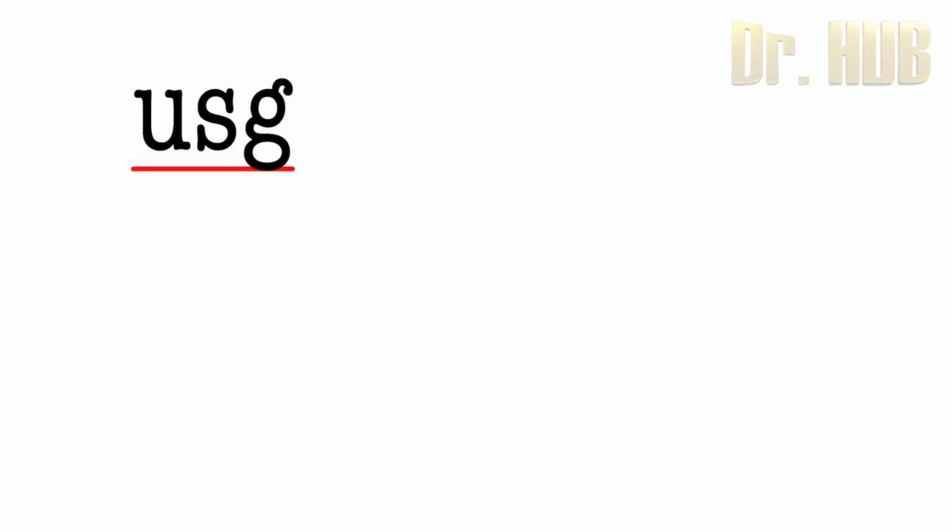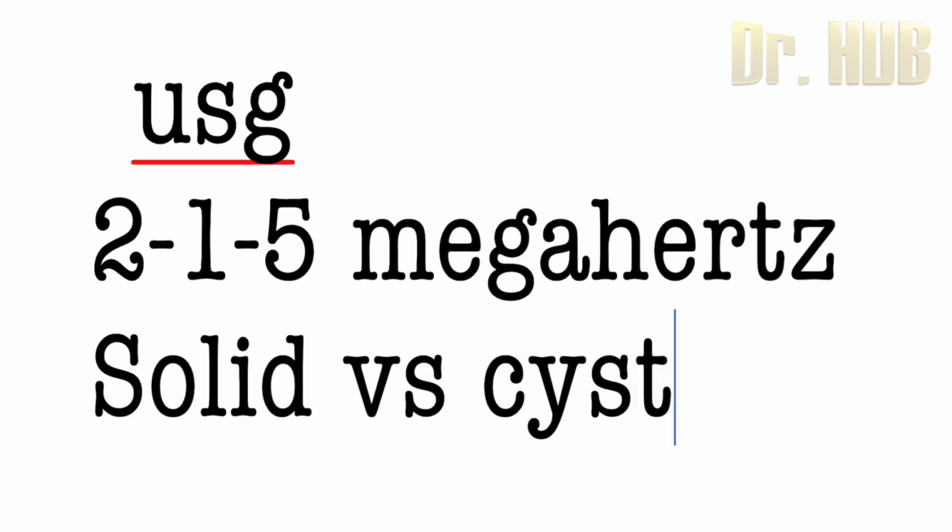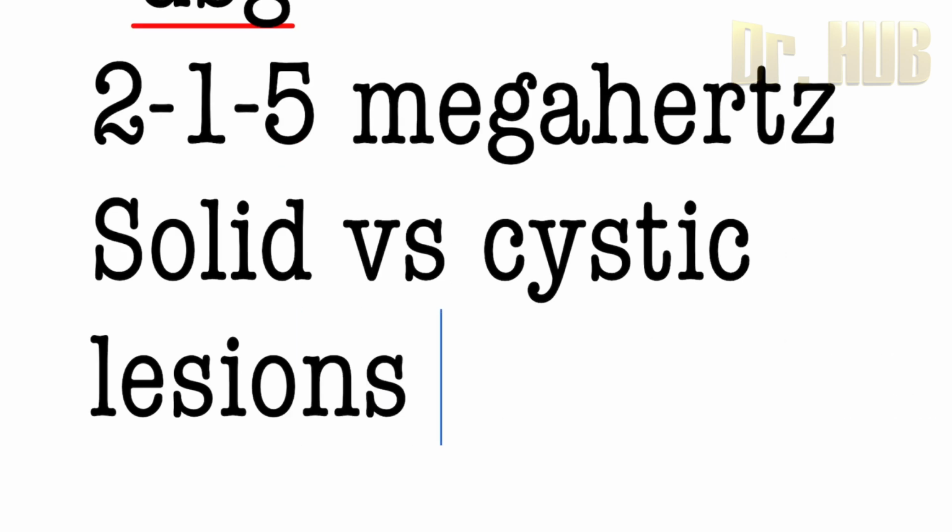USG uses 2 to 15 megahertz. And the USG is a better investigation to differentiate between solid versus cystic lesions. This is what is used.